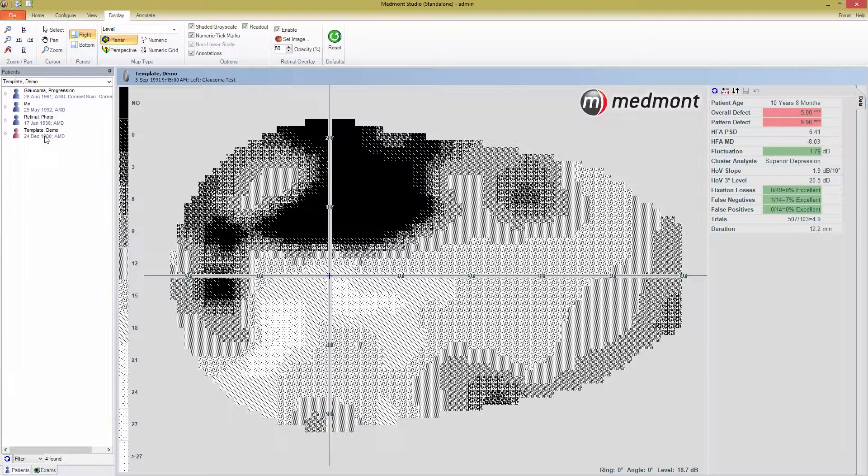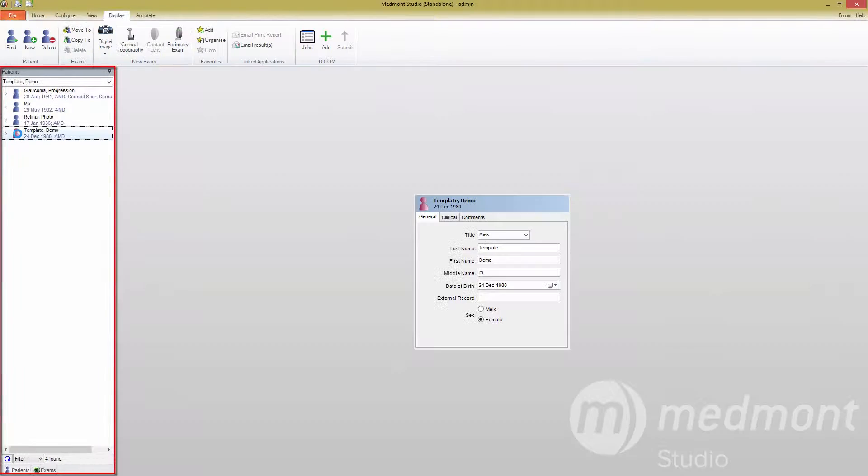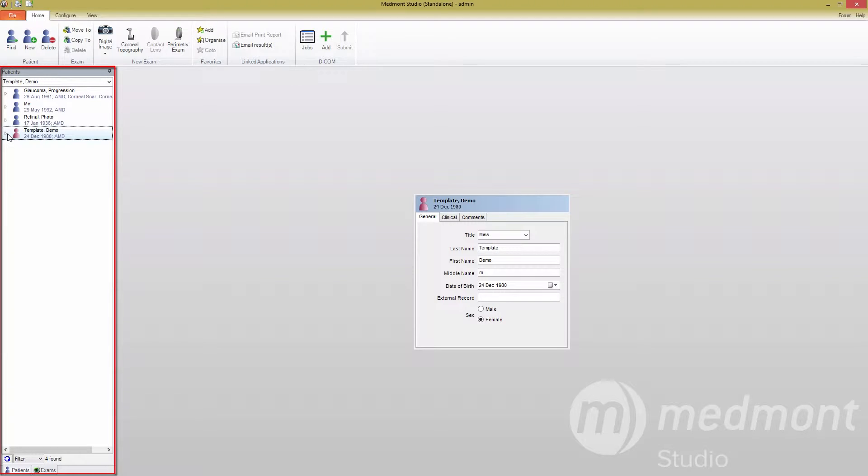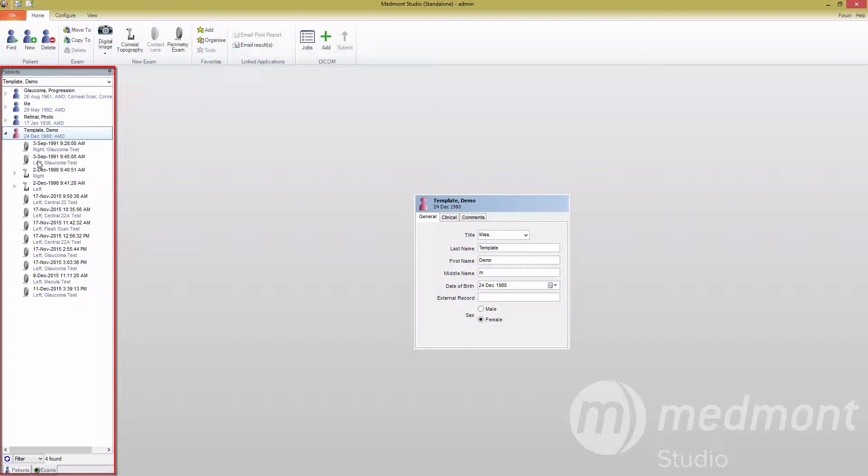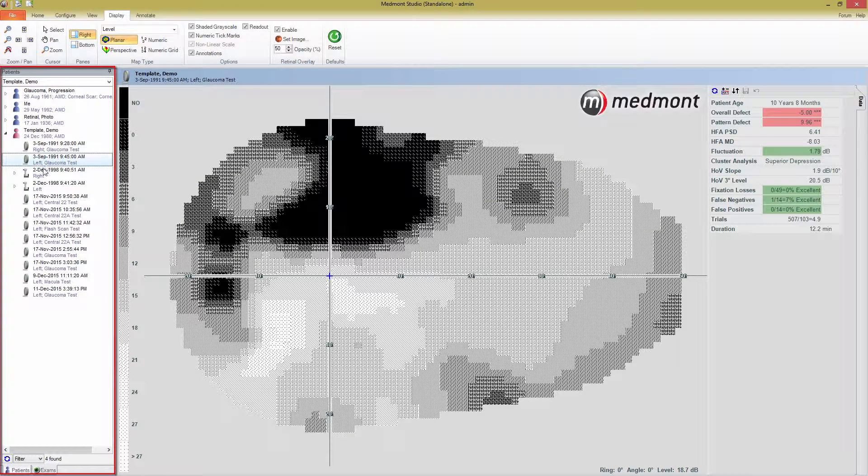To get started, select any pre-existing exam you have saved. In the far left column is a list of all of your patients. Double-clicking the patient name, pressing the right arrow key, or pressing the little triangle to the left of the name will expand the patient and show you all of the associated exams.